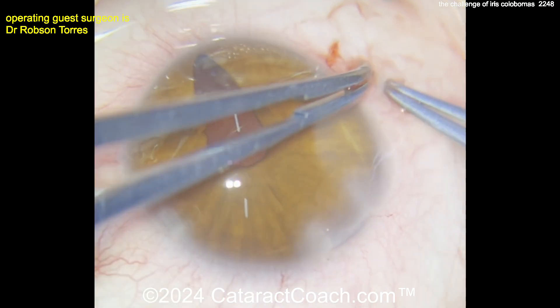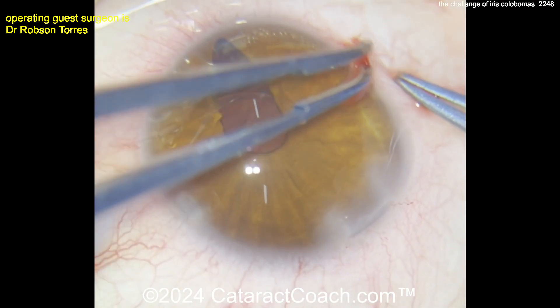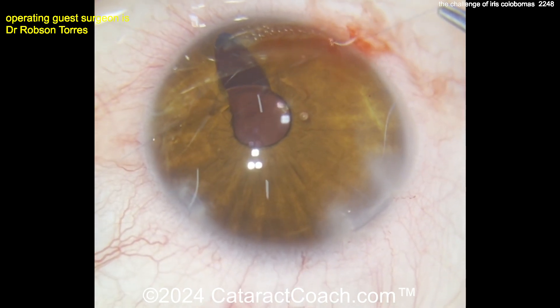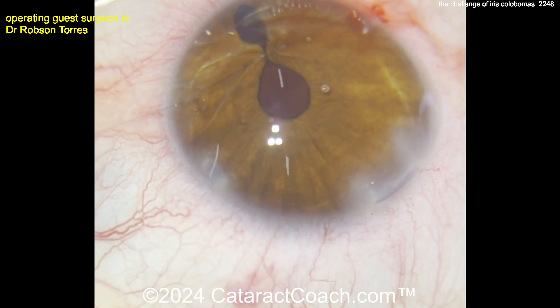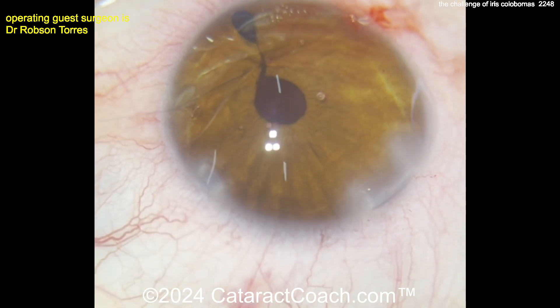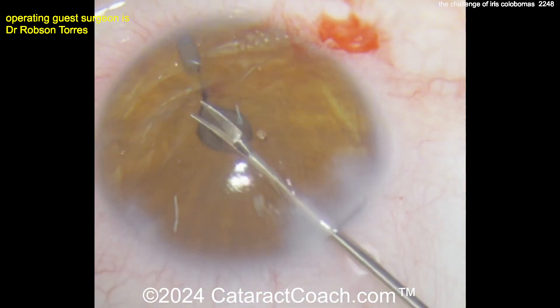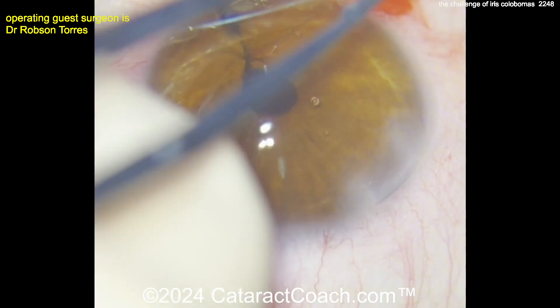The catch here is centering up the pupil. Once you close this iris defect, remember there's an absence of tissue here. Pulling the two suture ends brings it together very nicely, but it will also drag the pupil inferiorly downward toward the coloboma. Micro scissors are used to cut the suture, and probably one or two more sutures will be placed here.